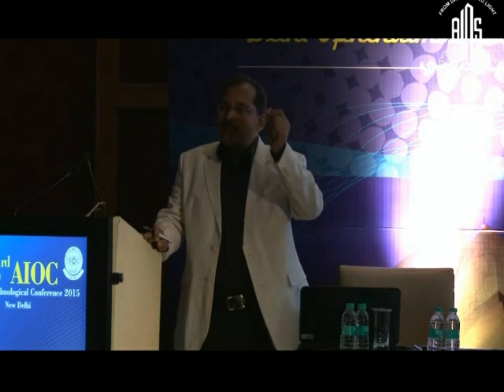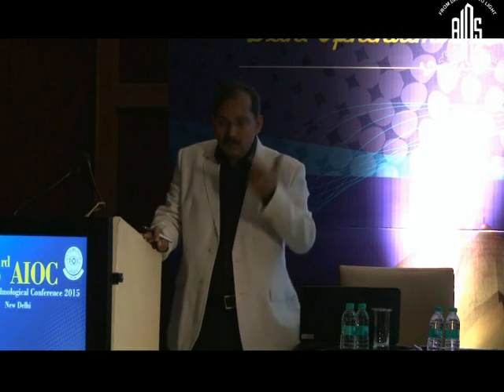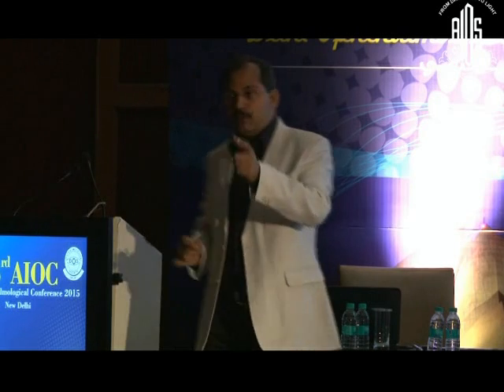Okay, if you give full correction and check the cross cylinder, he may not report much improvement because he is already 6/6. The vision has to be slightly blurred. So slightly undercorrect the patient in the spherical component so that he sees around 6/12, so that any improvement he will be able to report.